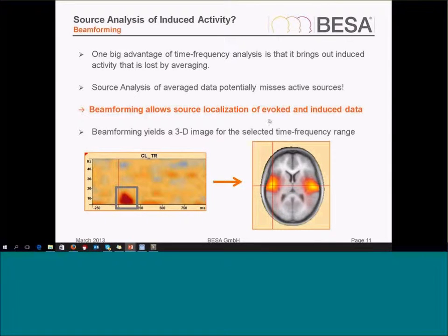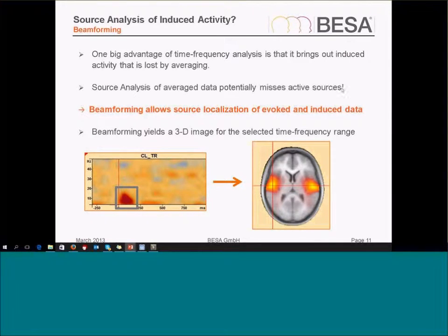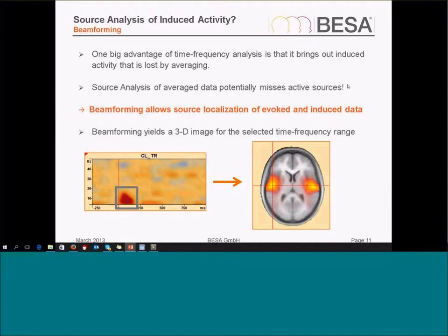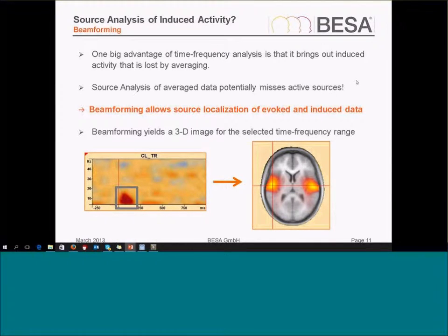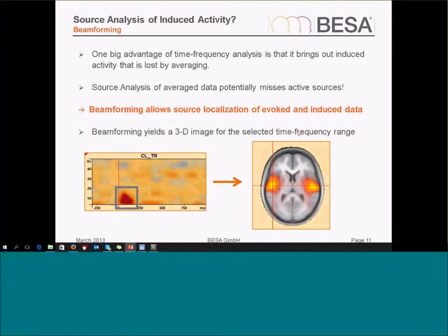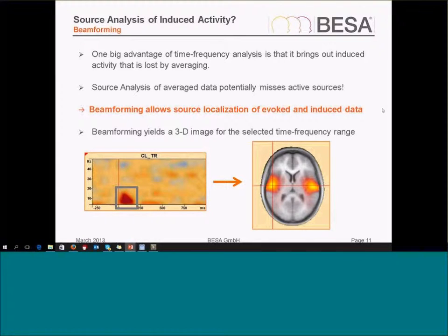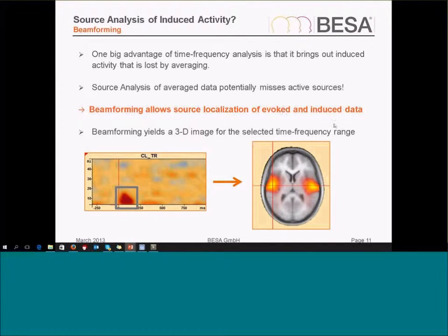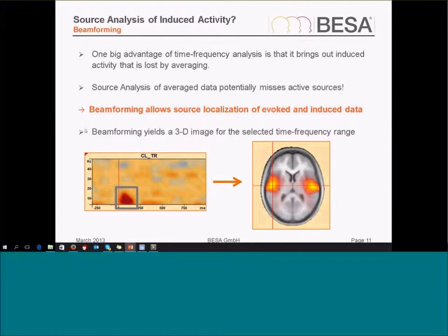Beam forming is a nice alternative way of source localization, and in BESA research it's realized as a time-frequency beam former. That means we allow the source localization of evoked and also induced data, so both stimulus-locked and not stimulus-locked data can be source localized using the beam former. The result is a three-dimensional image for the selected time-frequency range.